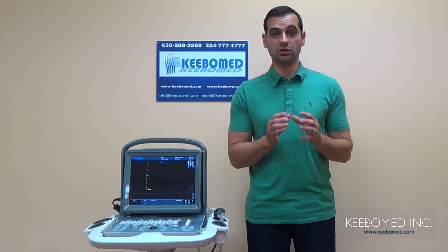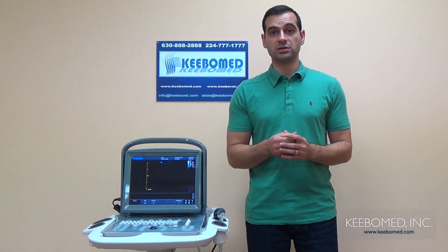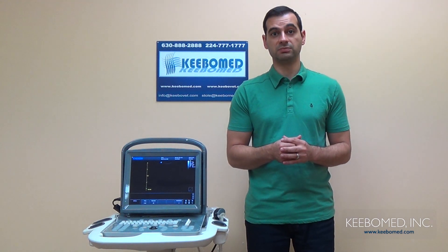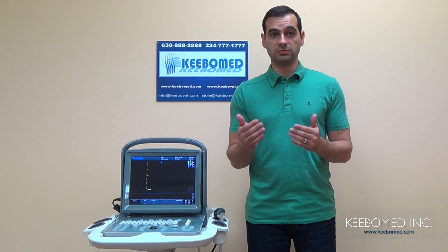The Eco1 generates very detailed reports as well. Actual images can be placed along with the report, which most machines do not have the same ability. The Eco1 also supports video printers, but also at the same time PC printers. This is a very important option because PC printers are less expensive and you have the ability to make detailed reports that feature images, measurement results, and patient information at the same time. A video printer is more expensive and usually can only print images.